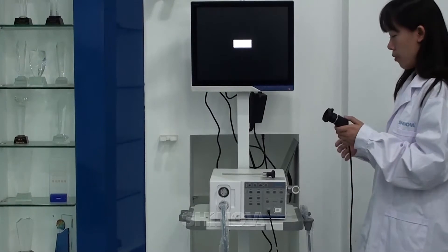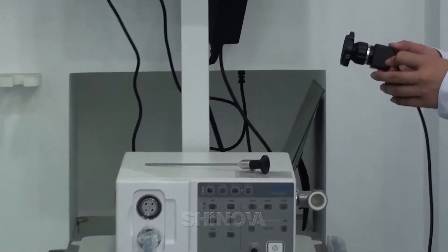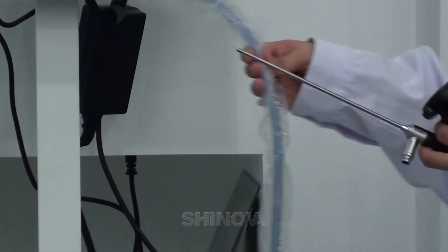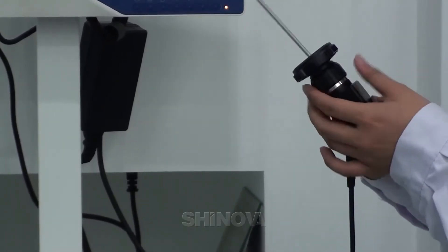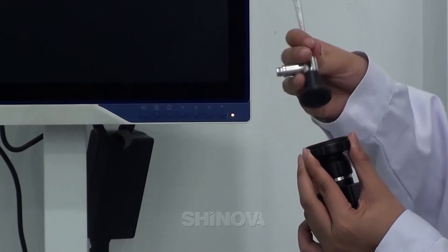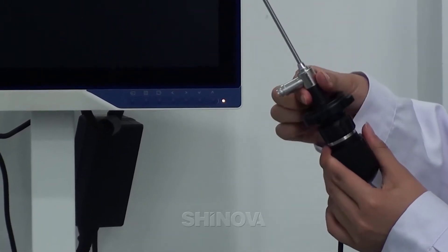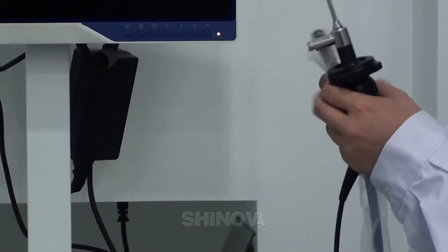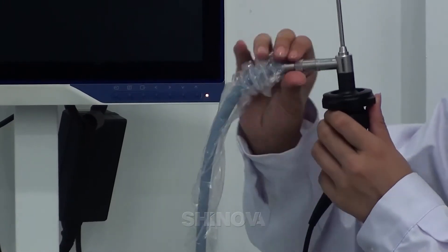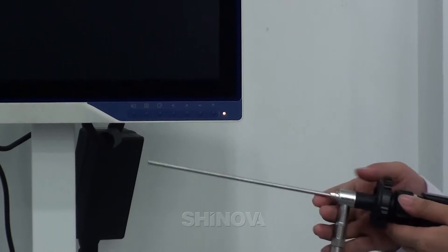Now I would like to introduce our original Innoscope to you. I will show you how to connect it. You can take this camera head, and this is our original Innoscope. This cable is the optical fiber cable. First, press these two buttons like this, and then connect the optical fiber cable from here. The Innoscope has now been connected to the processor.